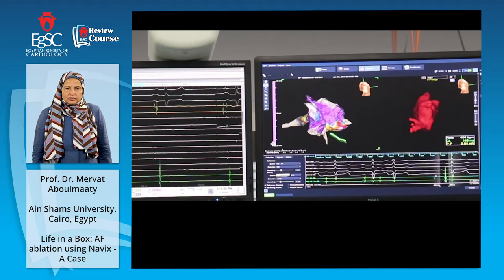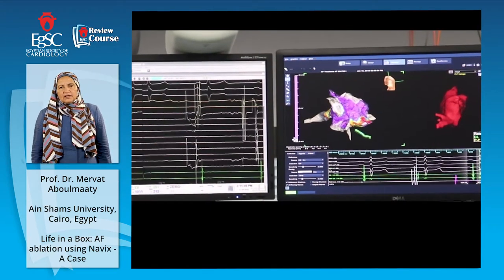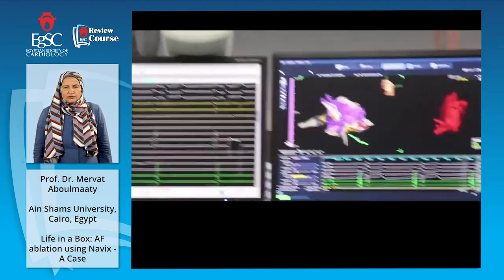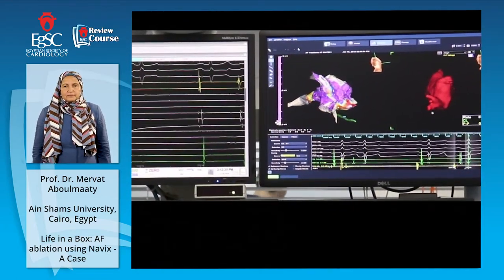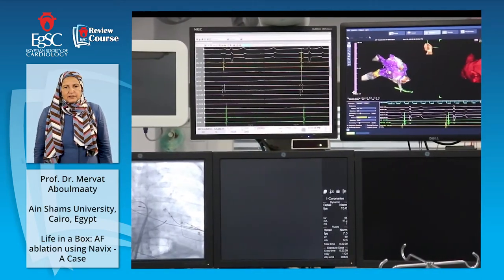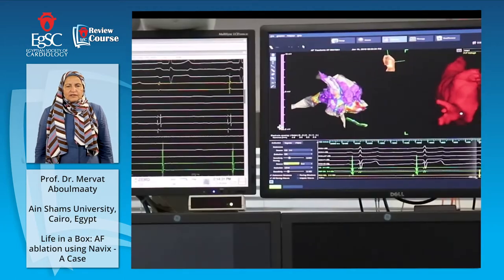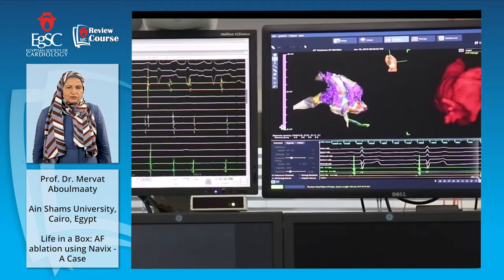The appendage is important, all the veins are important, and also I should get some volume in order to finish the virtual picture I am having. This is a continuation of the map I'm making. And then we look, comparing: is there any place to be taken better? Confirmation and also identification of the ostia. If you look down, you can see in the fluoro that the two catheters are moving. I change between this one and that one in the fluoro down.